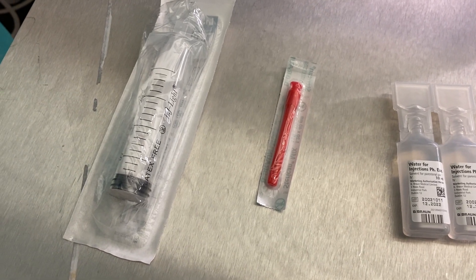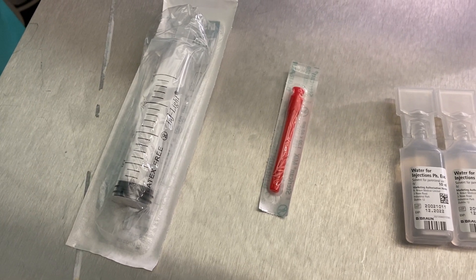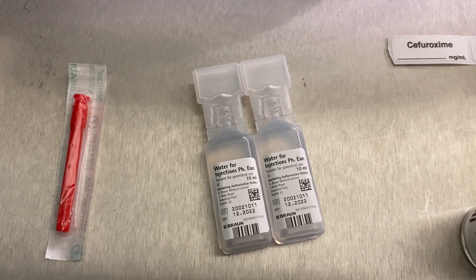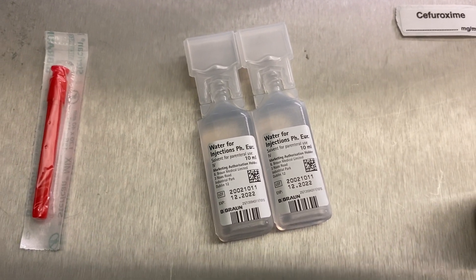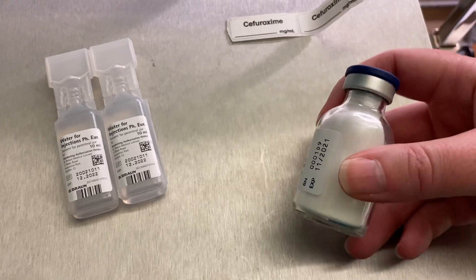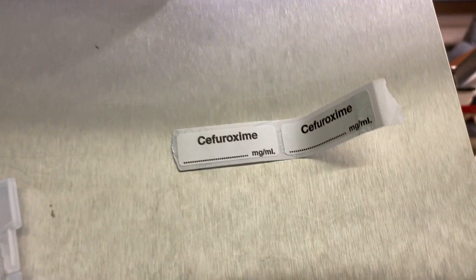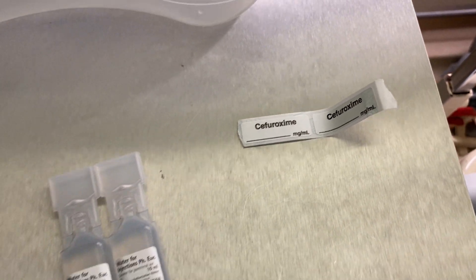A blue needle is a bit too small and it'll take you ages. Try and go for a green or even white needle, and if you have access to these blunt drawing up needles then they are ideal. You have 20ml of water for injection — check that it is water, it's what you think it is, and that it's within date, in this case December 2022. We have the drug itself, in this case we're going to be making up Cefuroxime 1.5 grams, and labelling afterwards. So we either have a label ready or have one of those blank labels that you can write something on.